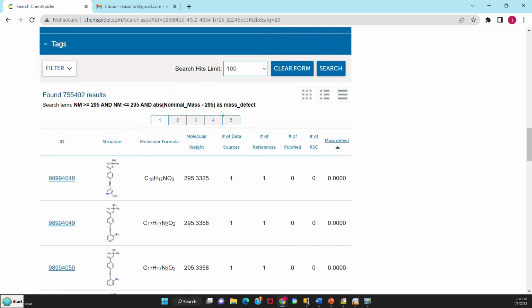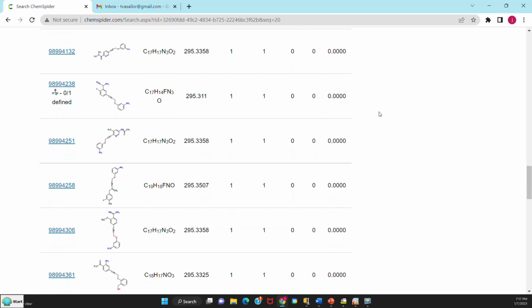So I pretty much just searched and it found 755,402 things. Of course, it only showed me 100 because I had picked 100. I could go to 10,000, but when the numbers get this large, it's really nothing worthwhile to look at. You need to narrow your search. So those are pretty much the basics of using ChemSpider.